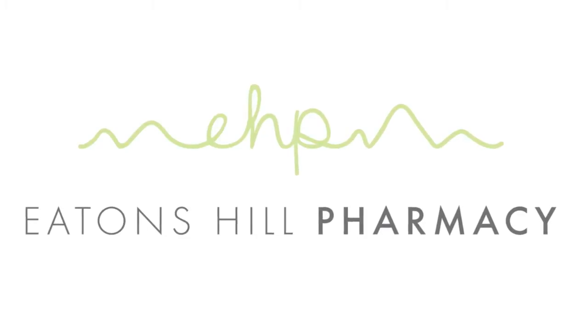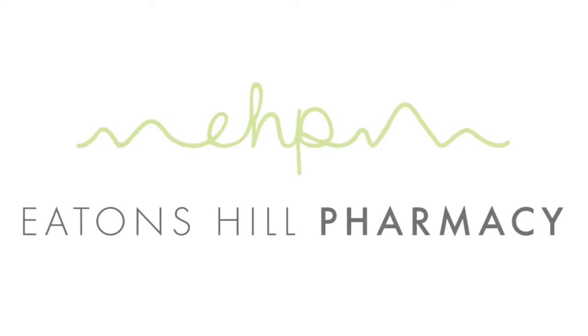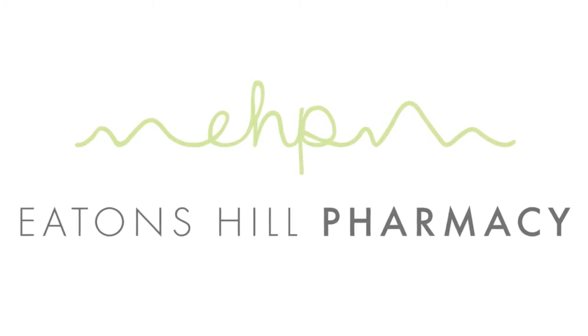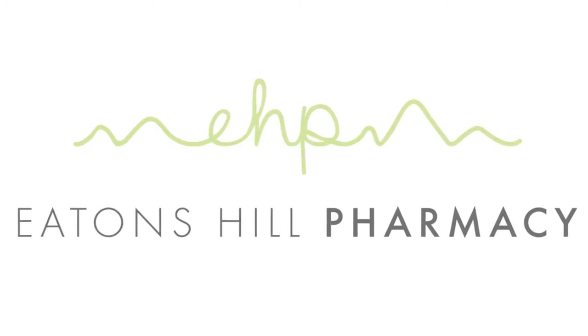Today we are going to show you one of our services: Cholesterol Screening. This is a free service we offer in store. We use the AccuTrend Plus machine, which is also available for sale on our eBay store and our website eatanshealthpharmacy.com.au.